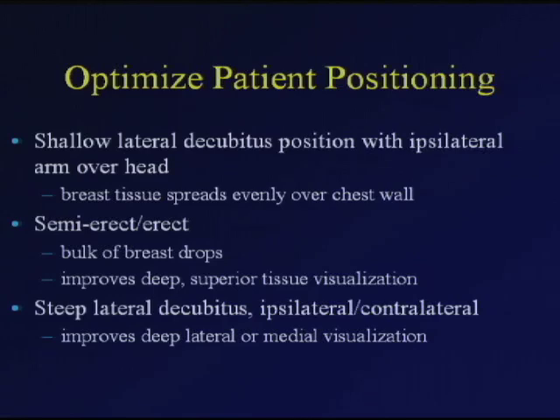But once in a while, you'll want to put her in a semi-erect or erect position. One reason is sometimes they can only feel a palpable lesion in the erect position. But the other thing is that the bulk of the breast will commonly drop down in the erect position, and that can help to improve tissue visualization in the more superior aspect of the breast. But also you may want to roll her over more, either to the more contralateral side or to the ipsilateral side, depending whether you're looking at the deep lateral tissues or the medial tissues.